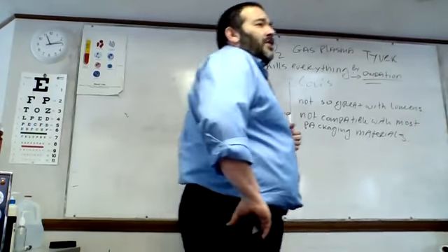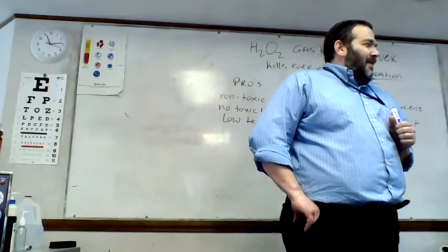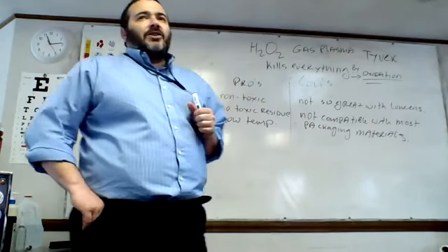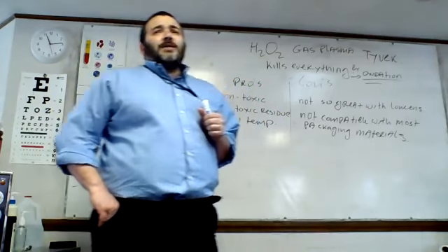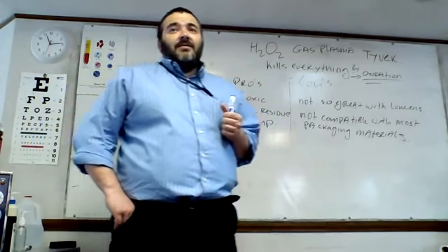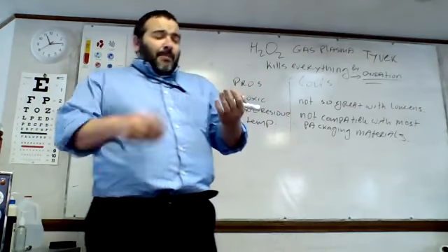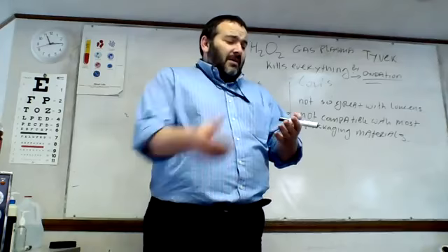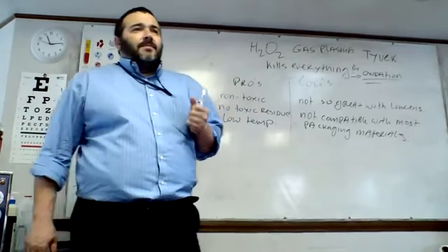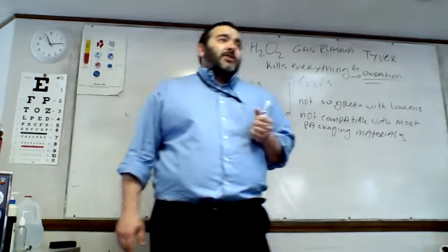Now, at high concentrations, hydrogen peroxide is toxic, and it will burn you. Because the hydrogen peroxide that we have in our bathroom cabinet is at relatively low concentrations, the hydrogen peroxide that we have in the hospital inside the sterilizers is at high concentration. So, can it harm you? Yes, it can. It can burn your skin, not permanently, but I had a couple of drops fall on my hands. They looked like they were covered by ash. Looked like a burn. They were so white. So how can I put that in my mouth? Huh? It's at low concentration. The one that you have at home is at low concentration. It's not going to do anything.